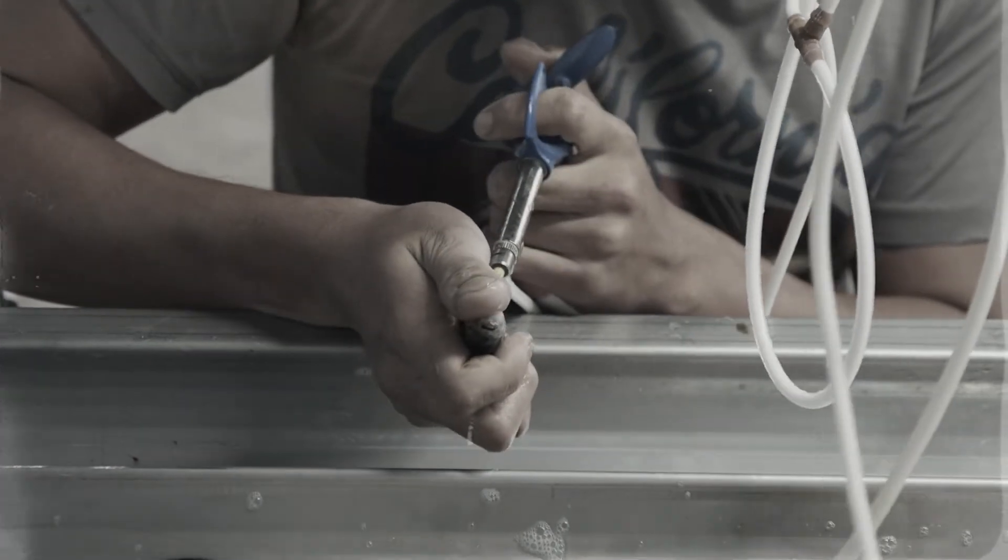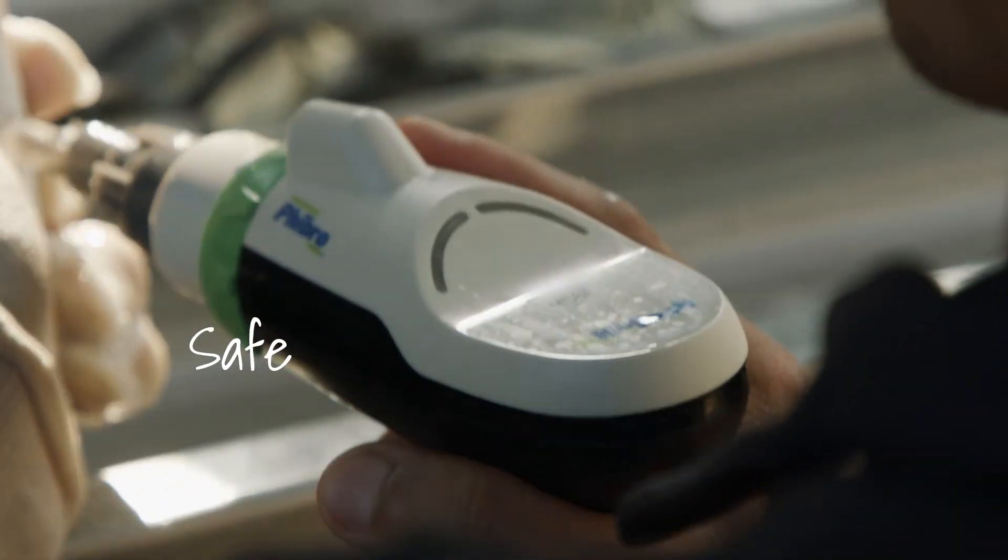Unlike these outdated manual injectors, Phytek for Aqua makes fish vaccinations simple and effective.